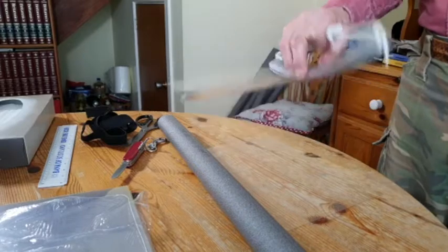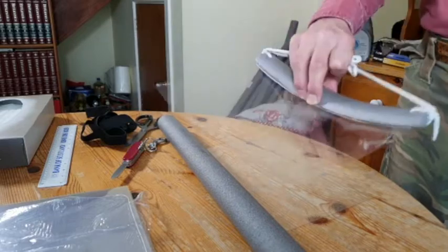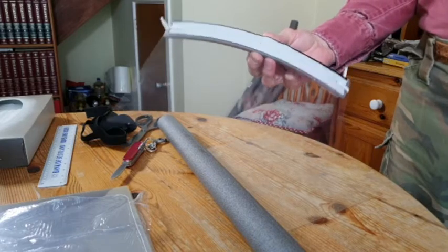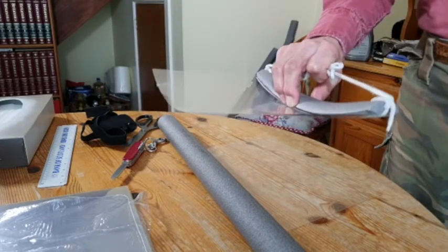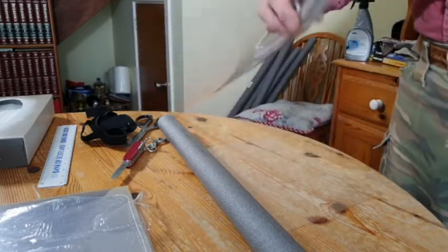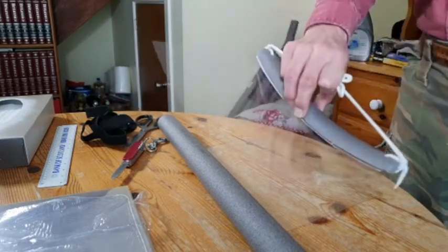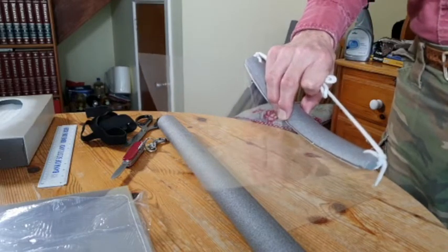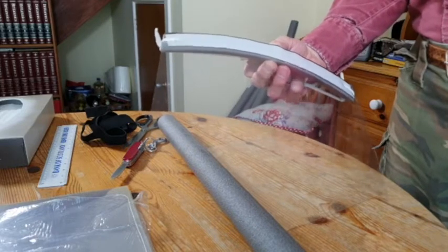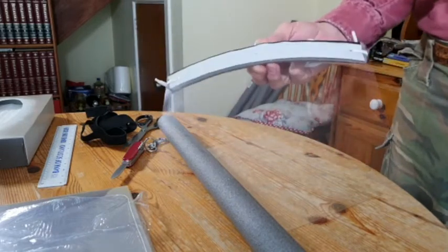Okay, this is how to make one of these, which is a visor for protecting yourself, and it is designed to be worn over the head, and it's simple to make, and it needs to be worn with a normal face mask. It's not officially approved, no liability accepted, should be used in addition to the normal face mask to P2 or ideally P3 standard.